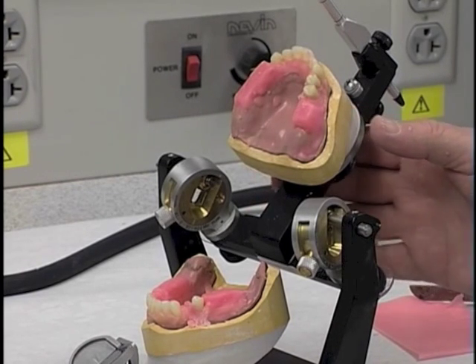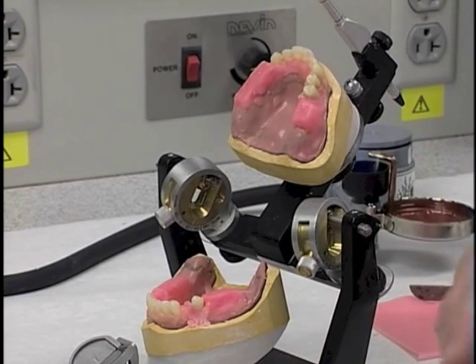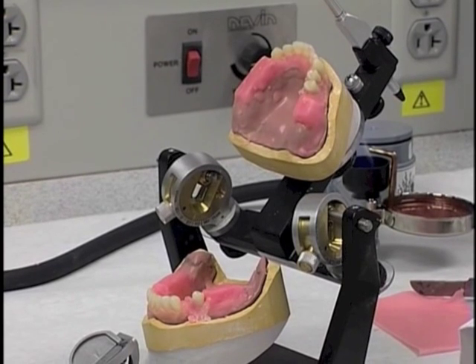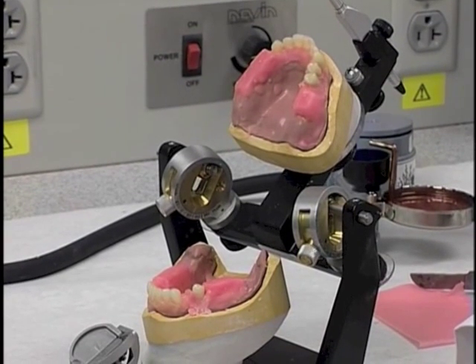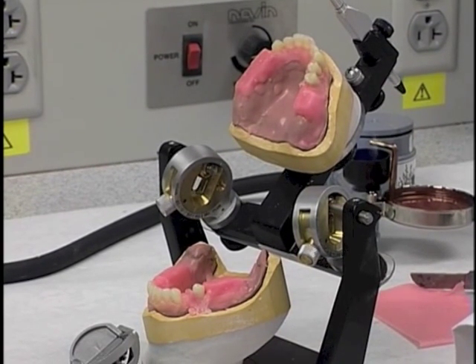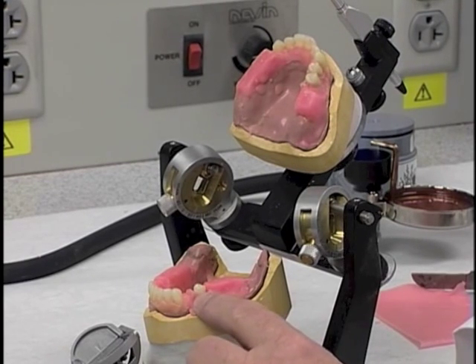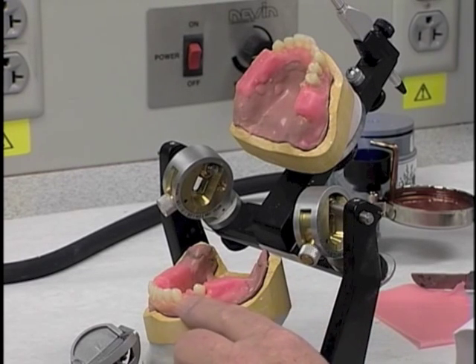This allows us now to finish our setup out with proper cusp fossa relationships of the mandibular teeth to the maxillary teeth. So what we will be doing from here, we'll be finishing out, since we know the position now of the mandibular second premolar, we can finish out our mandibular arch as far as this quadrant is concerned.